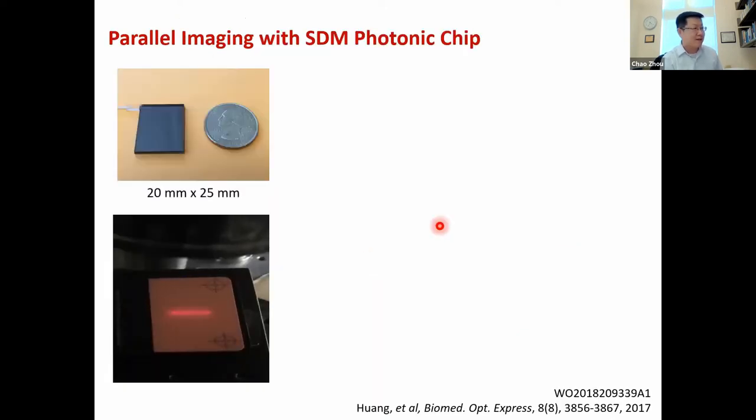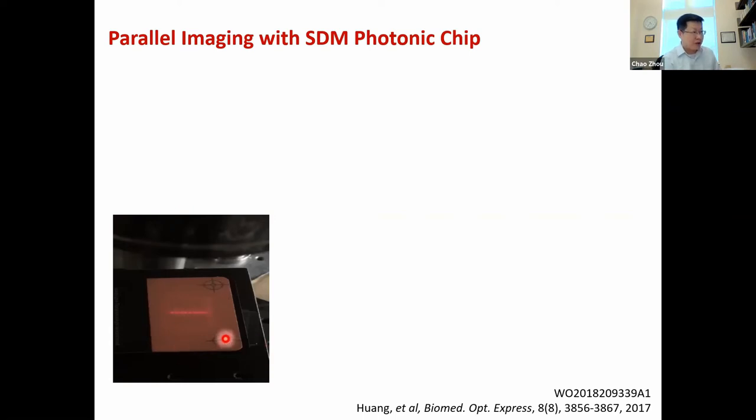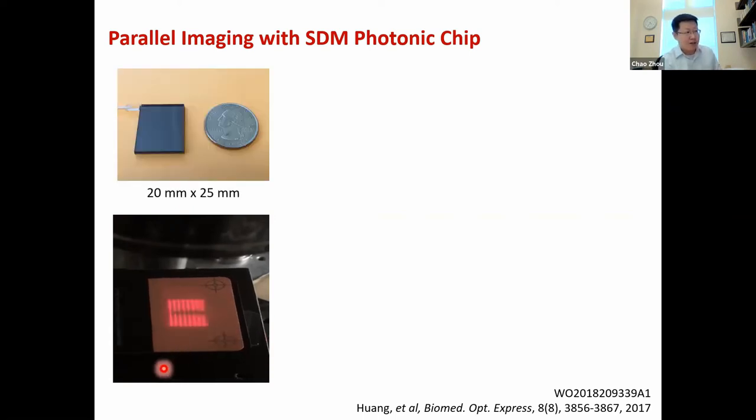I'll just show you some of the demonstration we did before. So what you see on the lower left, you can see 8 different beams scanning on the sample. In this case, the sample is the IR card because for OCT imaging, although I mentioned we are using laser, it's really safe. It's a near infrared light. We cannot see it with our naked eye. And also the power is less than 1 milliwatt for laser spot. So it's super, super safe. And so what I showed here is that you can perform parallel imaging to scan 8 different locations at once.